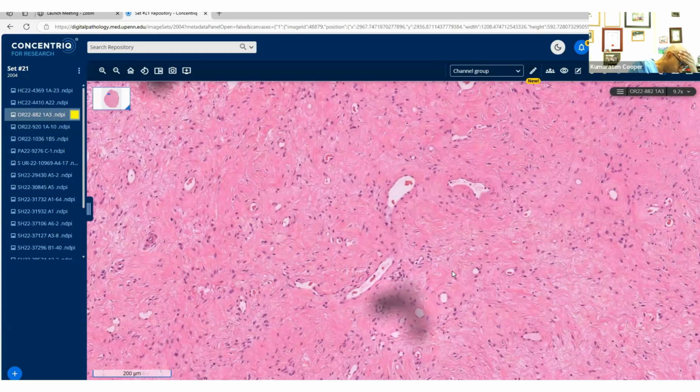It's also to emphasize that the mesenchymal tumors of the lower female genital tract, i.e. angiomyofibroblastoma, cellular angiofibroma, myofibroblastoma, and even the superficial angiomyxoma can occur in males as well. So they're not unique to women. They can occur in males as well. And in this instance, where you have the cellular angiofibroma, they can be ER positive as well. So they mark identical to those that occur in women.